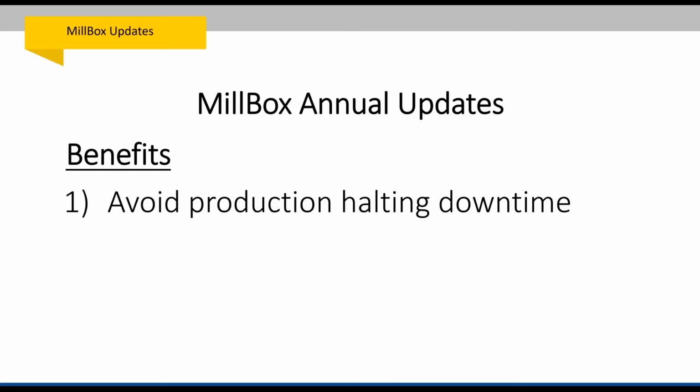All software companies now have to keep up with all these automatic updates. They do happen automatically to your computer. Didn't used to happen that way years and years ago, but just within the last 5 years or so, all software companies really have to keep up with Windows updates, security updates, all those things that automatically happen and really can potentially give you downtime on your computer, and we don't want to see that happen. So having access to updates as we keep up with all the technology out there is the best way to avoid downtime.